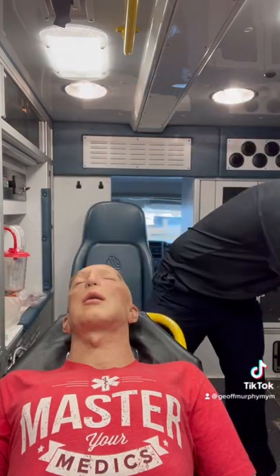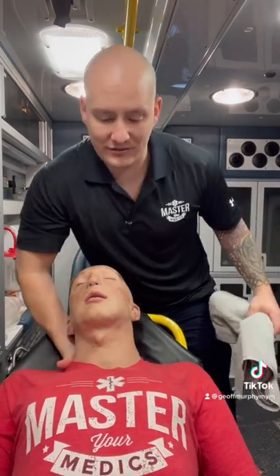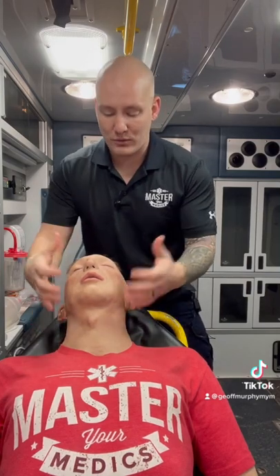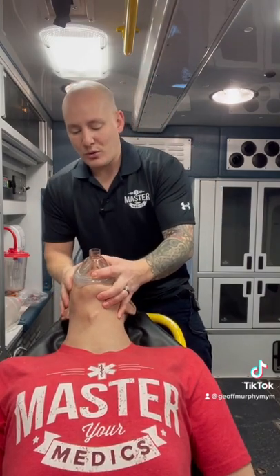The third thing is positioning of the airway. We want to get the patient into more of a sniffing position in order to actually ventilate them. To do that without pulling back and creating more chance of a seal leak, we're going to put a towel or blanket underneath the shoulder blades — like so — which naturally keeps the head tilted backwards in a sniffing position. That way, when I have the mask on them, I don't have to work purposefully to pull them back to get a good sniffing position. This naturally allows that already.